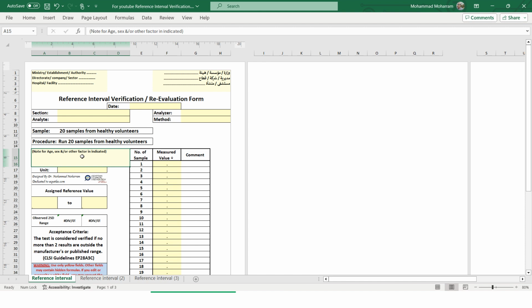For example, if I'm testing hemoglobin, there is a reference range difference between the newborn, the children, the adult male and adult females. If I'm collecting the sample in the early morning at 8 a.m., this may cause a significant difference in some tests such as cortisol, compared to taking the sample at another time of the day, and so on. Also consider medications, family history, and so on.